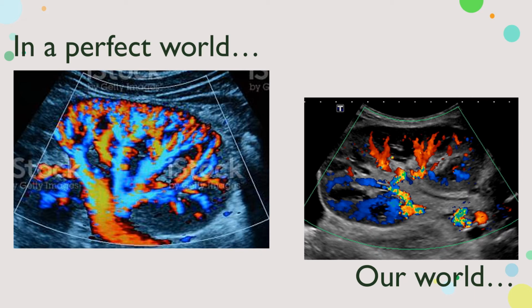And so there are some areas that look like there's great perfusion. We're seeing mainly the vessels that are supplying that region, and we're not actually seeing the perfusion itself. And so what about those areas that don't have much color at all? Are those diseased areas? Are those ischemic areas? We don't know. It's a technical problem.